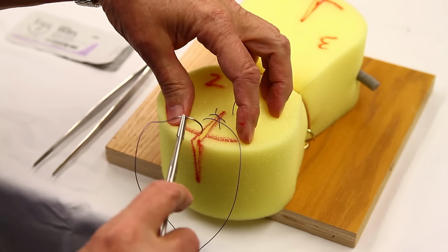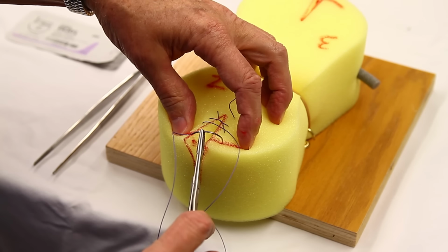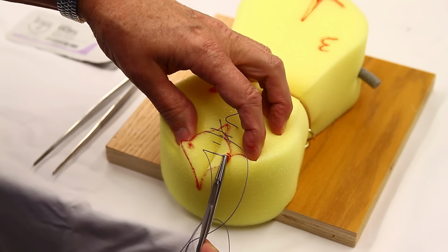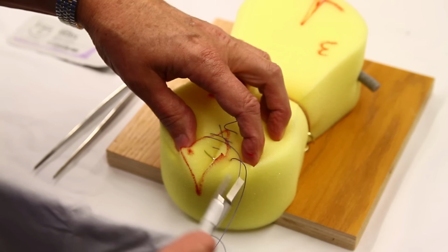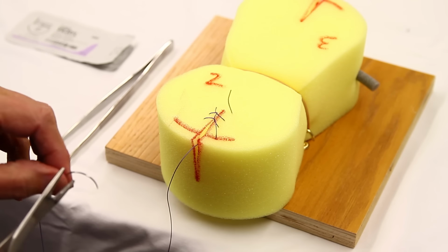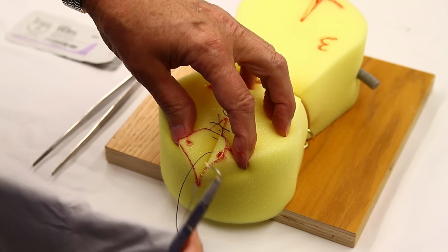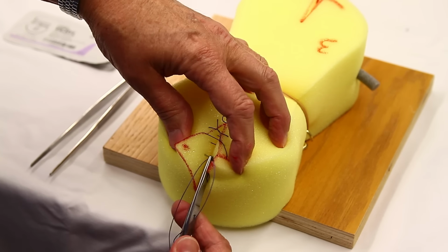The next bite's going to go right into the hymeneal ring, but this one's not going to go through and through. This is a transition stitch. We're going to go through the hymeneal ring and deep into this laceration and come out inside the laceration. So now we're working inside the laceration. We've transitioned from the vaginal wall to deep inside the perineal muscles. Go straight across and then come out on that red dot.